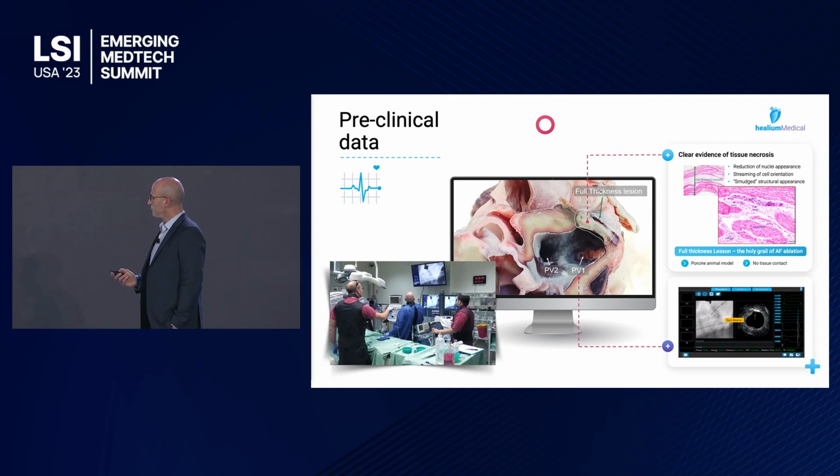When we show this type of images to physicians, they are usually pretty impressed with the homogeneity and continuity of the lesion. You can see that it's very transmural, and we validated it through histopathology to make sure that it's also necrotic, meaning that it's permanent.